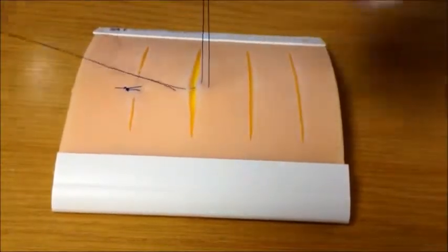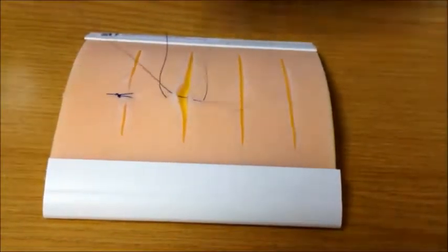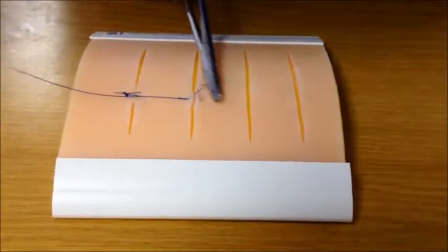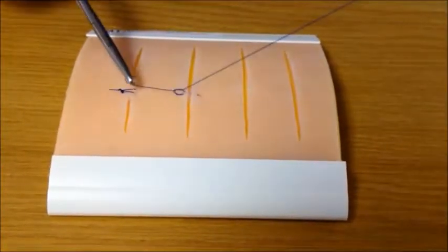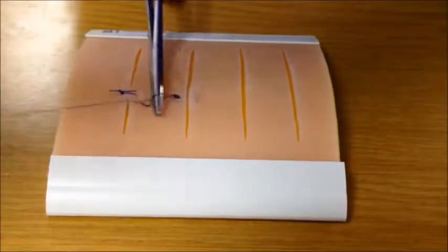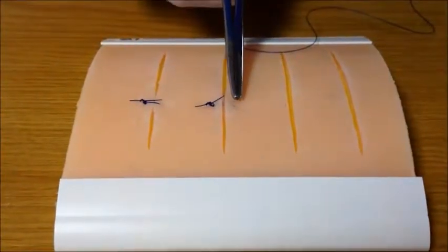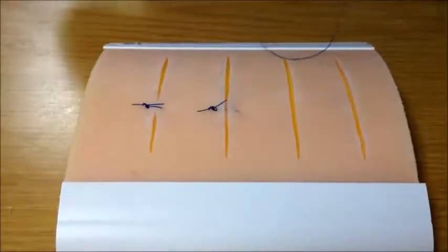Pull the suture material through until you have just enough to tie the knots. Tie the knot: wrap twice, pull across, then once and pull across, and finally twice and pull across to complete. You will notice that the suture lies to the side of the wound with no material crossing it, and that it results in slight eversion of the wound edges which may promote wound healing.